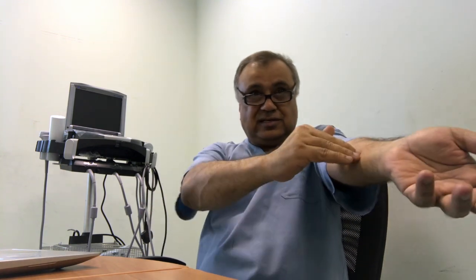So anatomical terms of location are confusing with the axillary block. If you have an anatomical orientation in your brain and you have the anatomical orientation of ultrasound guided versus the nerve locator technique, then you are confused. If you are a beginner with ultrasound and you are used to the nerve stimulator technique and anatomical orientation, these will make you confused. What is posterior? You are saying down, down, down means this. Here down means this. Up means toward the brachialis.